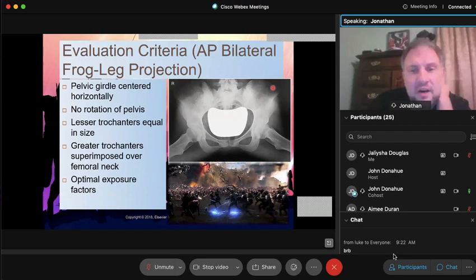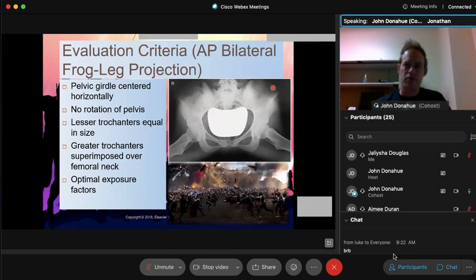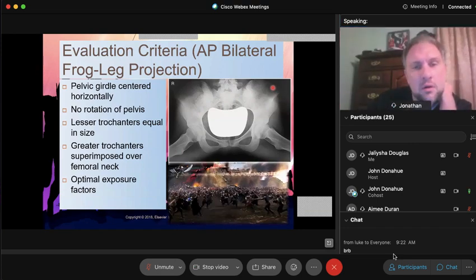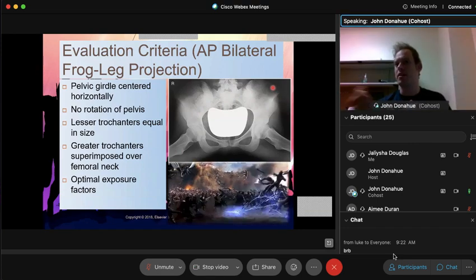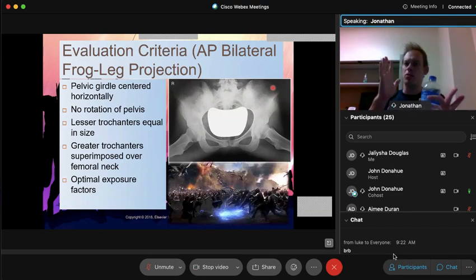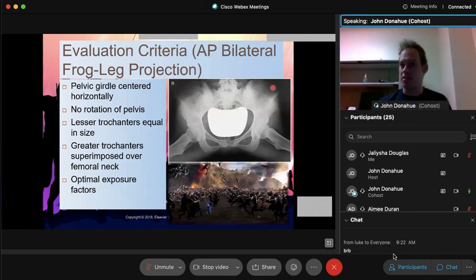Mr. Donner, you said if they're oblique, you'll see the obturator foramen. The opening is a little smaller. Is that what you're saying? Correct. They'll start to close off. And I'm going to show you some examples of that when we do some image critiques. As you look towards certain sides, they'll start to close. And that's an indication that the patient has obliqued themselves or been obliqued accidentally.